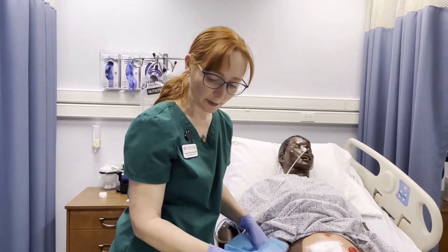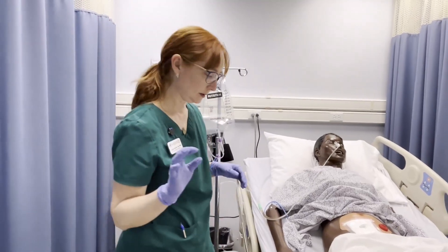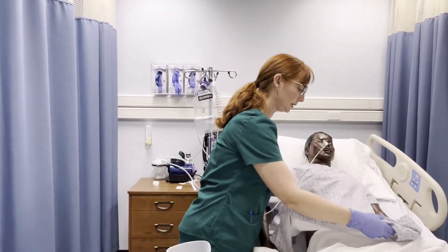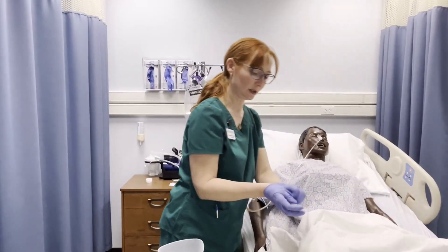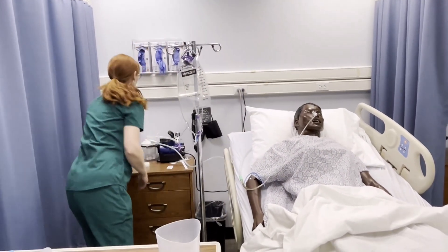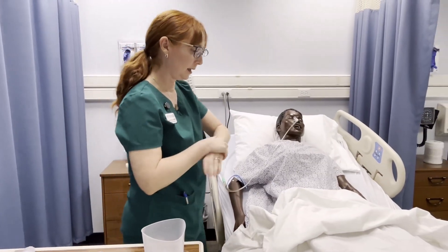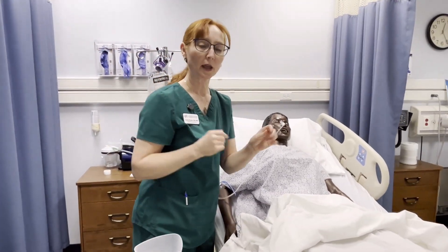Clean up all of your supplies, get the patient into a comfortable position, take off your gloves, and perform hand hygiene.